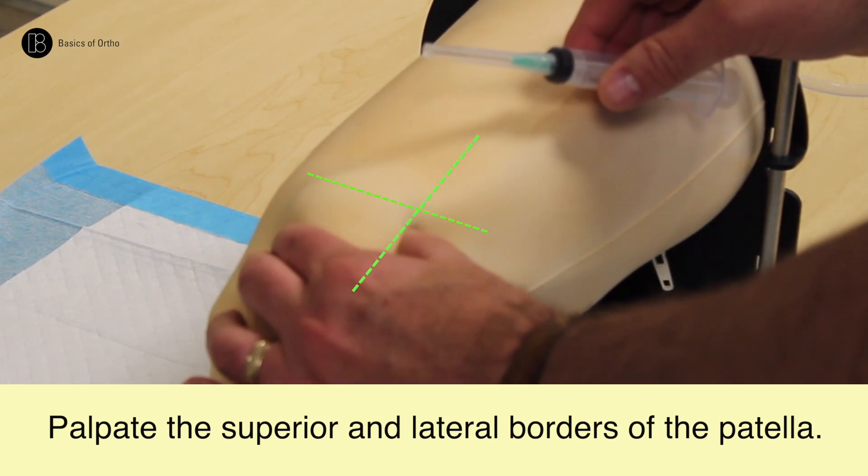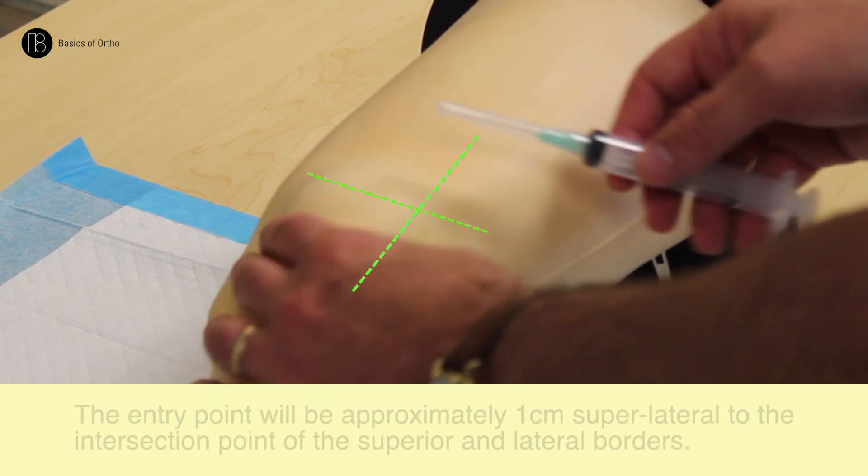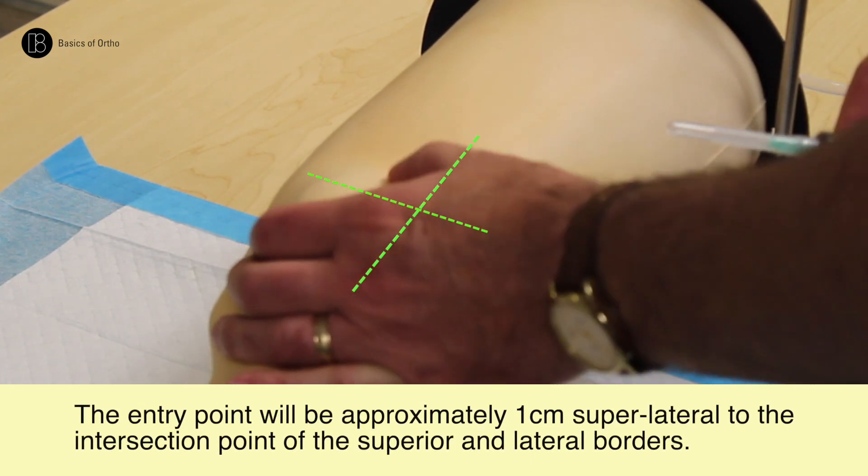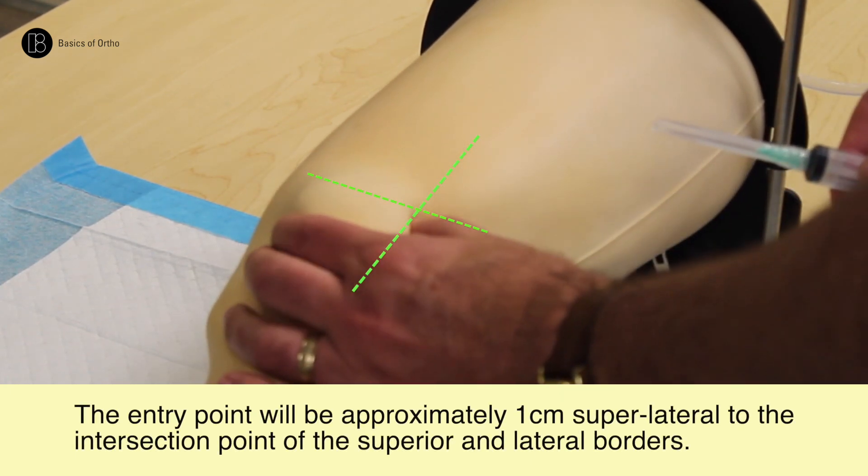Where these two lines intersect, the entry point will be one centimeter just lateral or just diagonal to that intersection point.